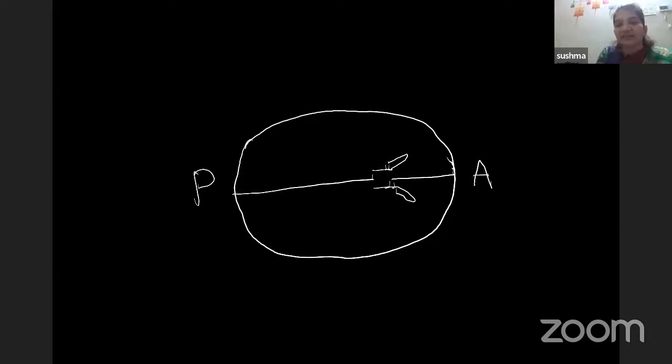So in the transventricular plane, as we have seen before, this is the frontal or the anterior side. This is the occipital or the posterior side. And between the anterior one-third and posterior two-thirds, we have the cavum septum pellucidum, which is a box-like structure flanked on either side by anterior horns of the lateral ventricles. And here we can see the occipital lobe.